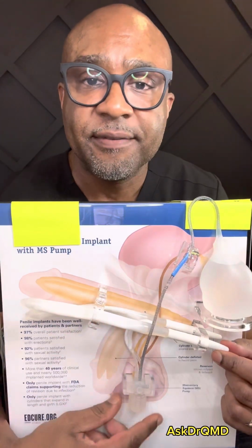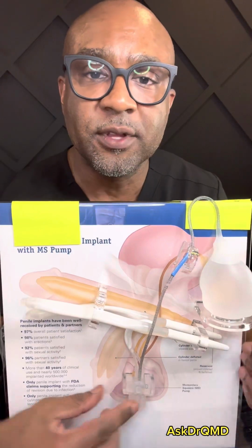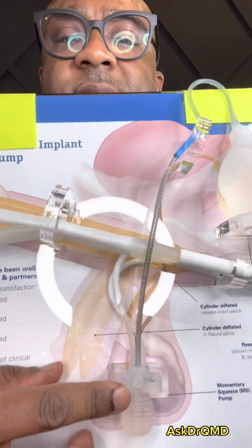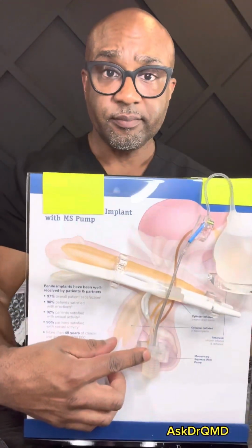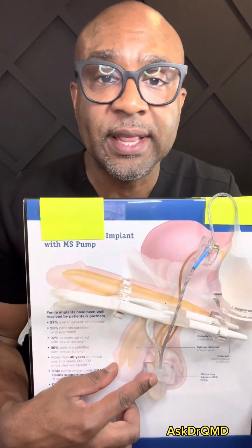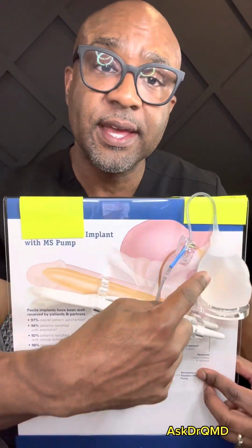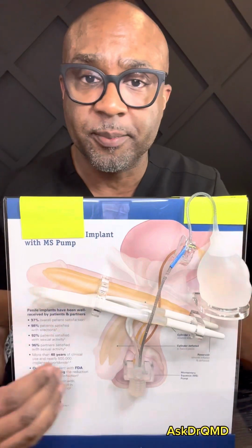You then have a pump that fits neatly inside the scrotum. And if you look closely, this pump has a little button. I don't know if you can see it there, but there's a button right here. Now that button is what you hit to release the valve to allow the fluid to go back from the prosthetic into the reservoir. Okay, so you're just transferring fluid back and forth.